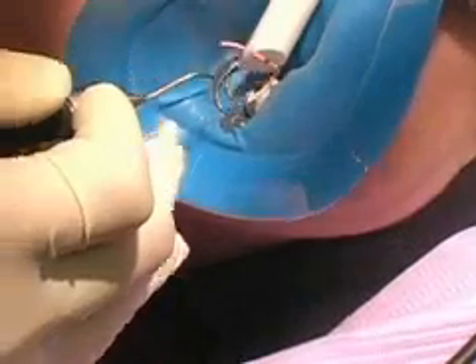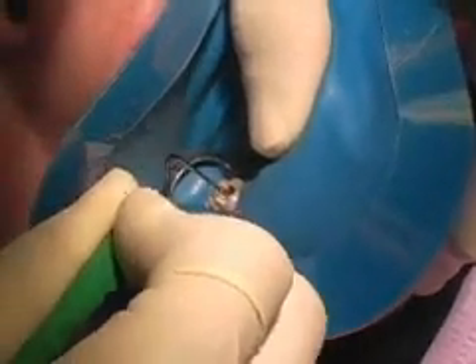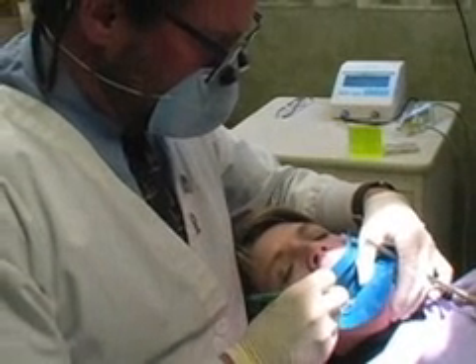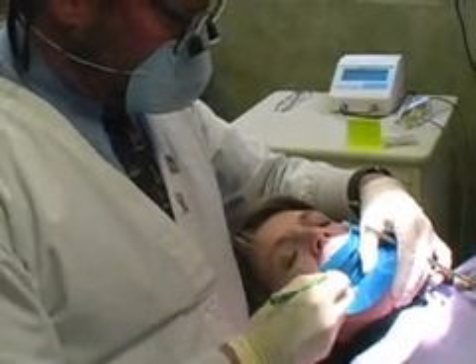Then we melt off the tops of the gutta-percha points and push the rubbery filling back into the root. What we try to do is hermetically seal the tooth off with these gutta-percha rubber points so that bacteria can't get back into the root. That's why we pack down the filling.